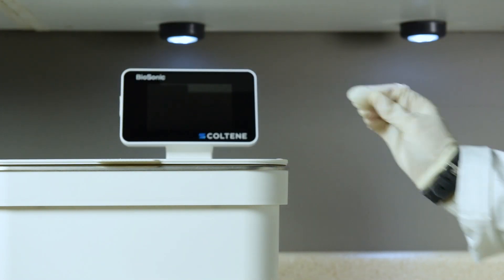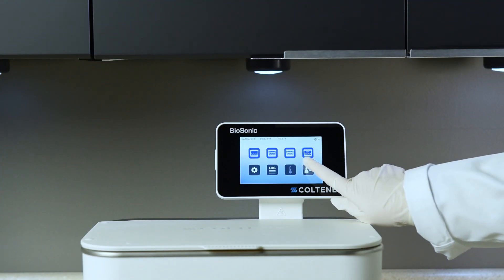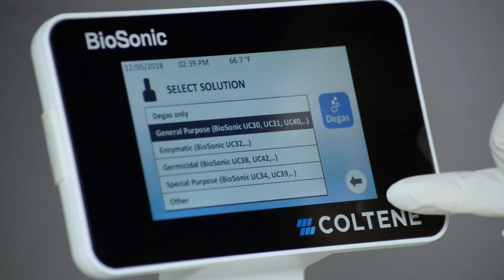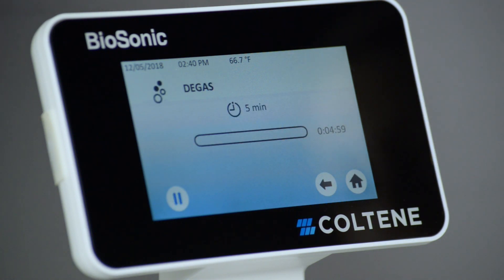After adding ultrasonic cleaning solution and water into the tank, press the degas icon on the main screen. Select solution type and press the degas icon to start the degassing process.